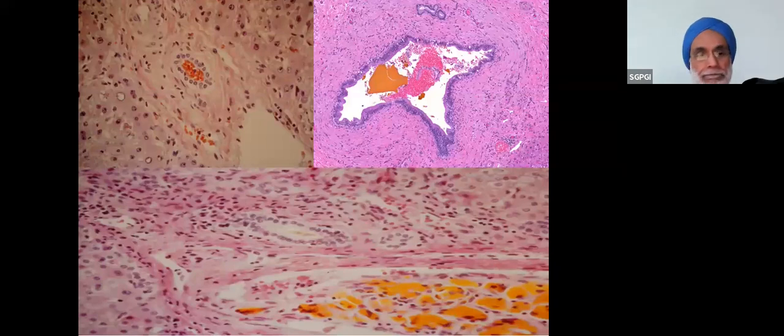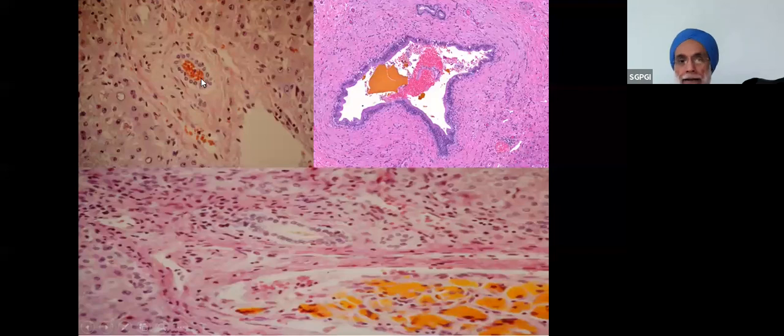Microscopic pathology. You can get blood in the bile ducts, and small amounts of red blood cells actually can even occur after a percutaneous cholangiography. But larger areas of hemorrhage suggest a fistula. For example, if there's a fistula between the portal vein and the bile duct, you will see blood in the duct lumen. So that's a serious sign. If you see bile in the portal vein, that again tells you there's a fistula between the portal system and the biliary system.